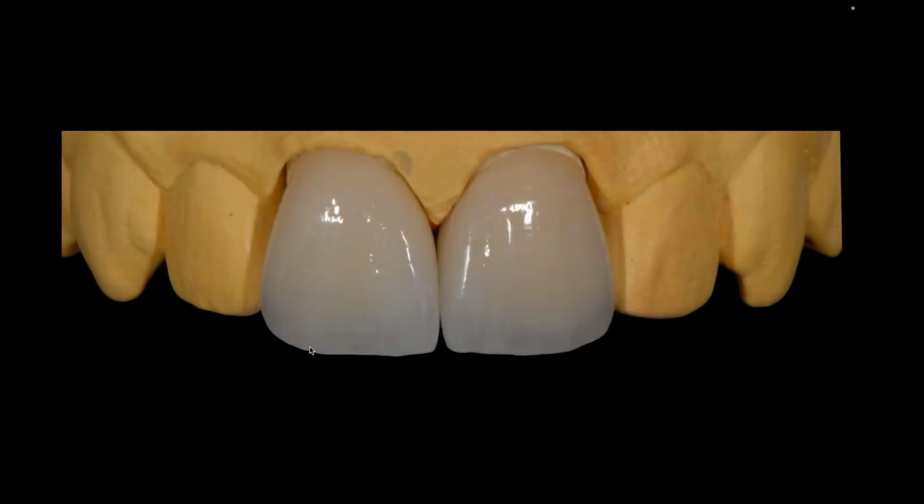Now, remember I just flipped them. So I think you should already know that this is the one that has the opacious materials. This is the one that is straight dentin. And just so we're clear, I used 1 millimeter of A1 dentin and 0.5 millimeter of the enamel, just like the manufacturer recommends. Where here I use 4 opacious dentins and then maybe 0.8 of a millimeter of dentin and 0.4 of a millimeter of enamel, right? It changes the measurements out a little bit.